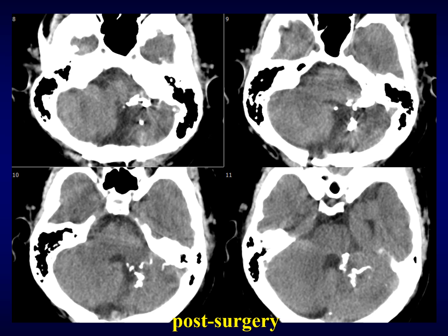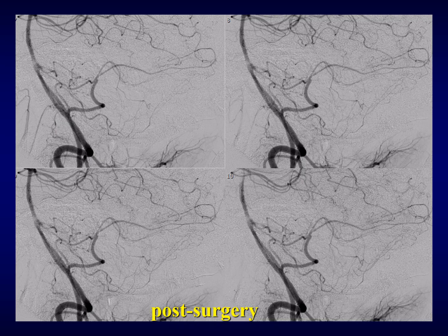What comes from the anterior part has been taken care of by the embolization. Angiography after surgery shows the complete eradication of the AVM.